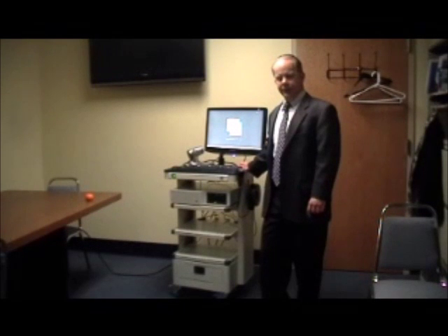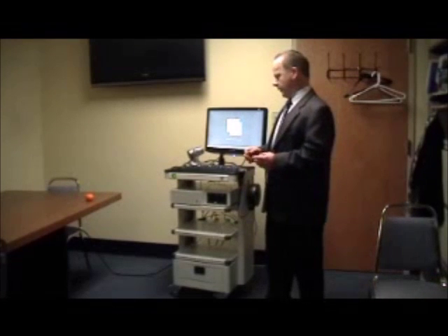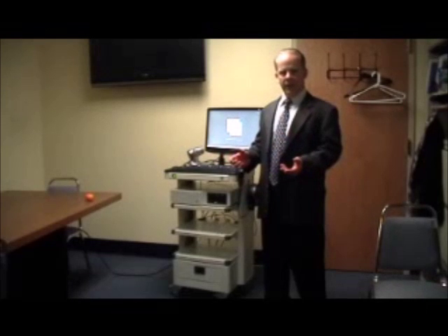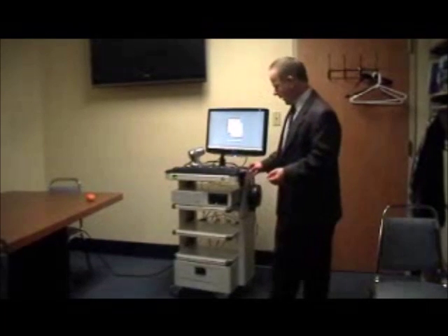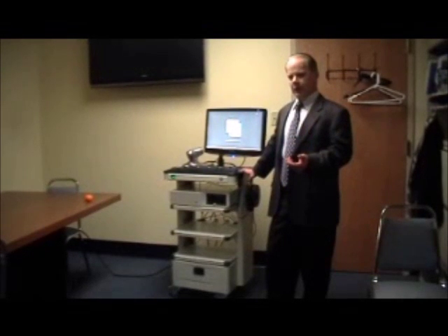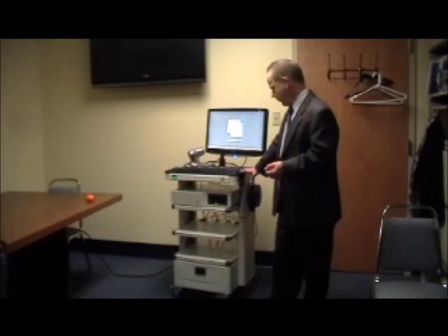Hello, I'd like to talk to you today from Global Device Management about our new mobile cart for emergency department environments primarily. That's how we've got the cart set up here. We call this our Rapid Response Visual Documentation System for emergency departments.